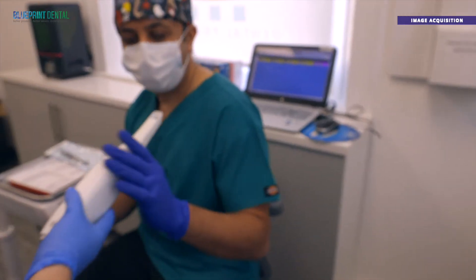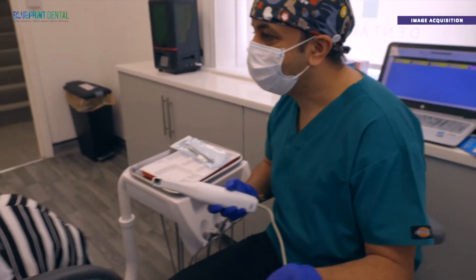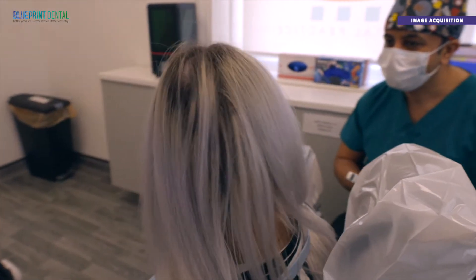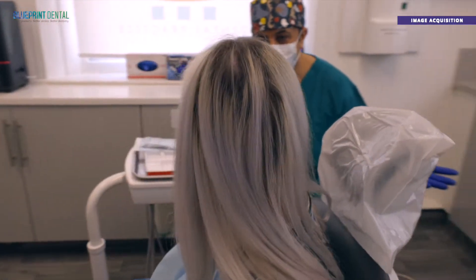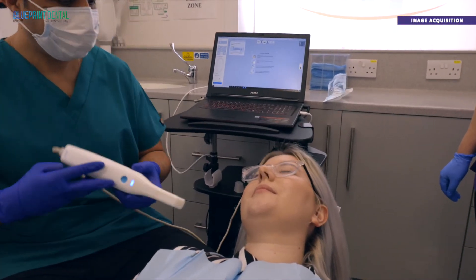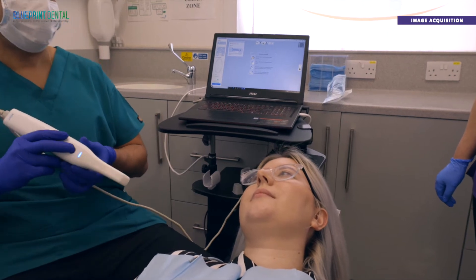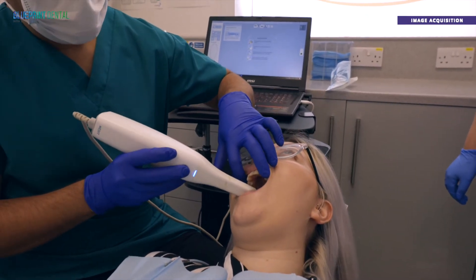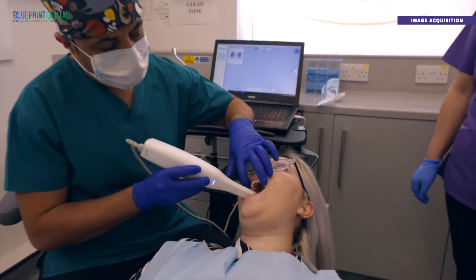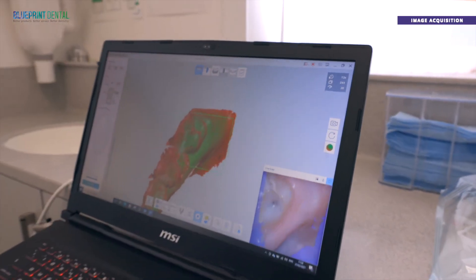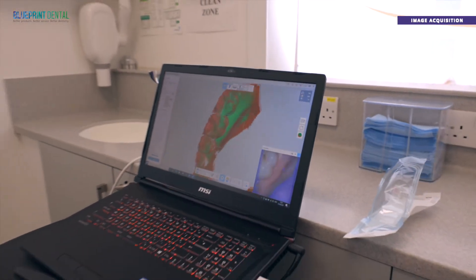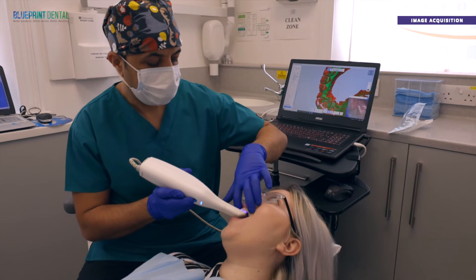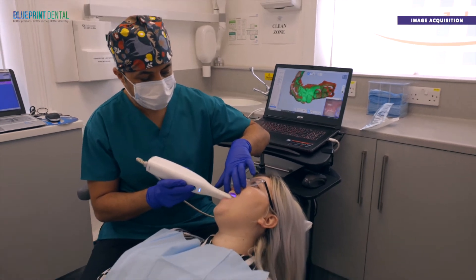You can see it's lightweight and maneuverable in all areas with a small tip, so whether you're performing a full arch or single tooth scan, it's comfortable for both the patient and the dentist during the scanning process. Images are captured on an open system for integrated CAD/CAM workflow, so when the scan is complete it can be transferred to the lab for fabrication.